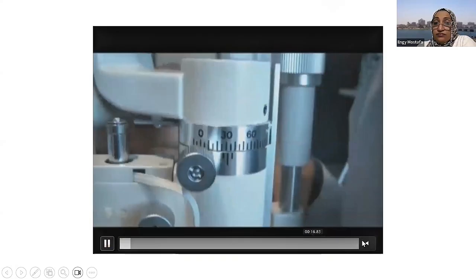tear film in the diffuse examination, and then you can examine the lids and the lid margins, looking for blepharitis. You can see the openings of the meibomian glands, like the pouting of the meibomian glands, and even see that they are inspissated and blocked by dry secretions.